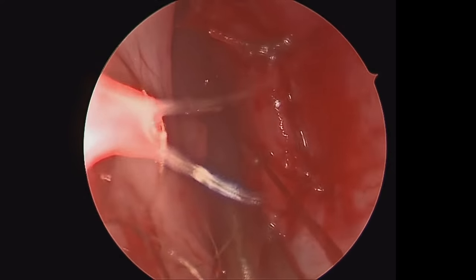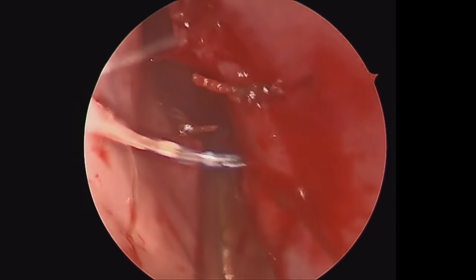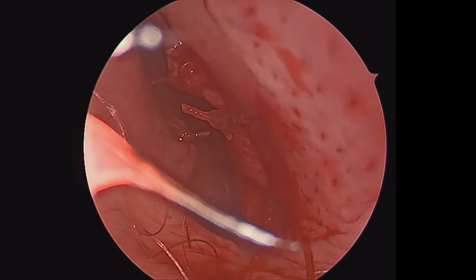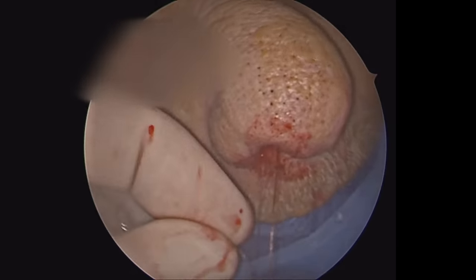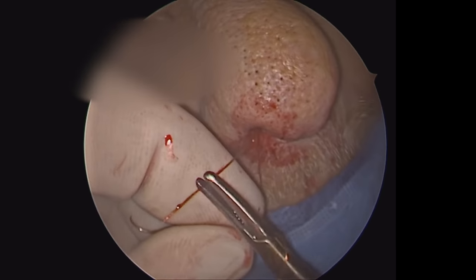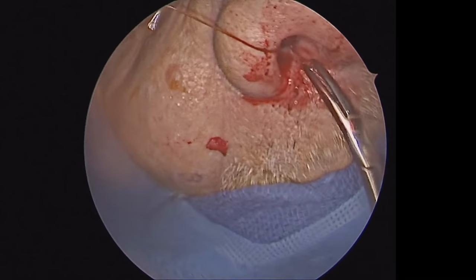You can also close this with a running suture, but I prefer interrupted sutures. You can do this with a headlight or with the endoscope. If using an endoscope, it's sometimes helpful to have an assistant hold the scope while you are tying. Three or four knots is usually sufficient. Re-grab your tail and push it into the nose to tighten your knot.